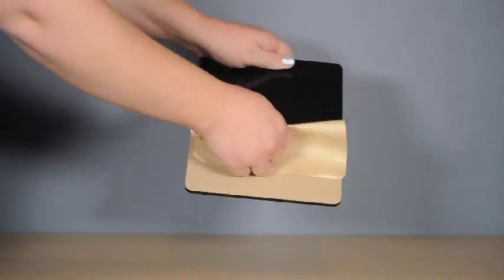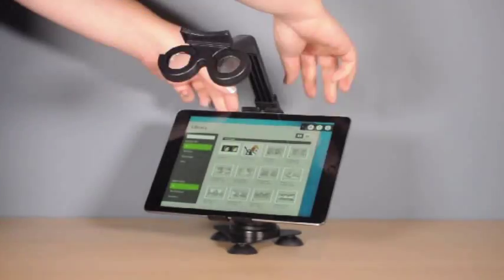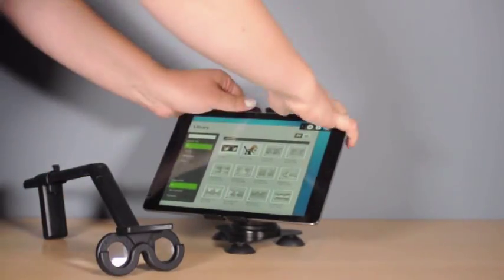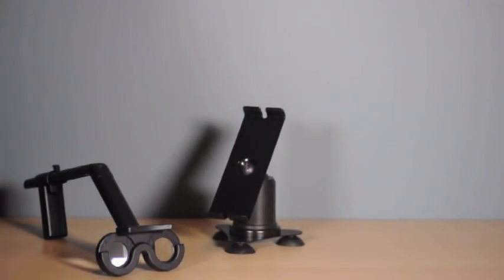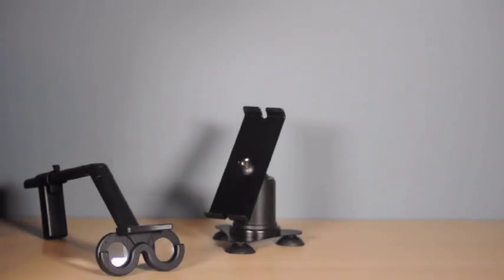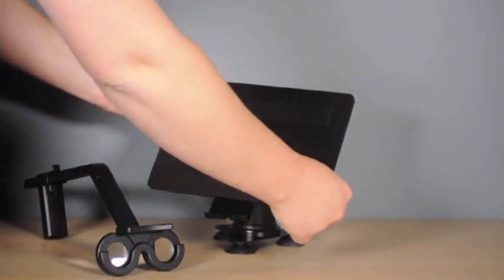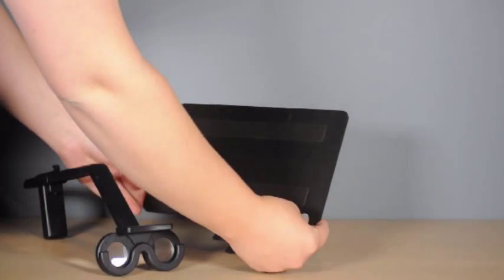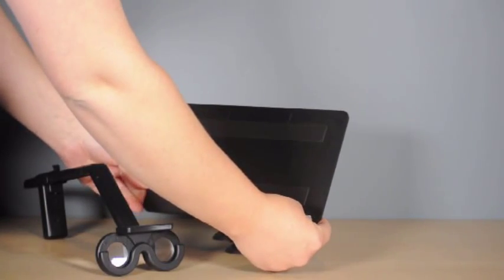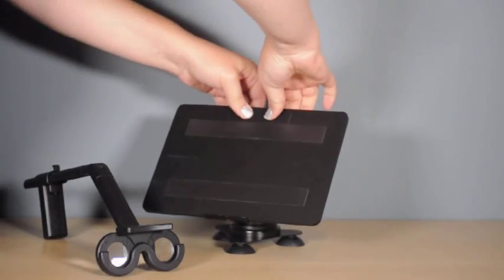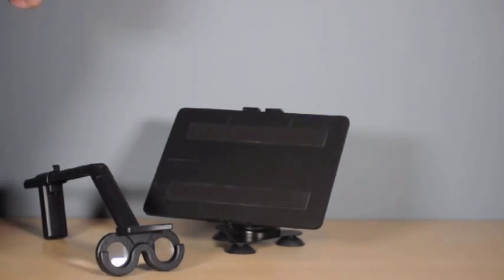Remove the stereoscope from the stand and pop out your iPad. Place the card adapter in the stand so that it rests on the bottom ledge. Use the embedded guidelines to center it, then press firmly at the top to secure.